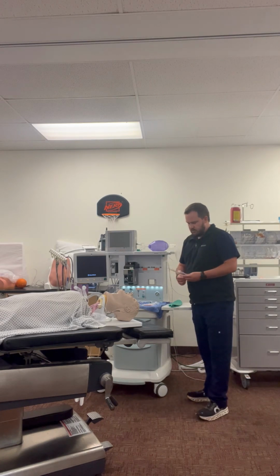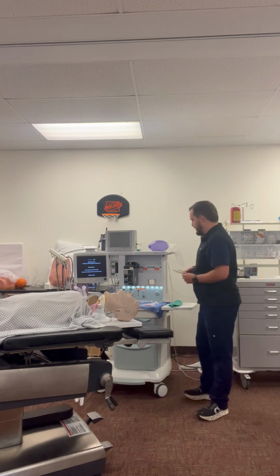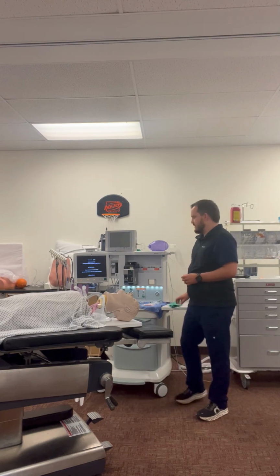We're going to be using oral RAEs. For this patient who's 5, he should have a 5.5 ET tube. So I'll have a 5.5, but I'll also have a 6.0 and a 5.0, just in case, once again, I need a different size for that.